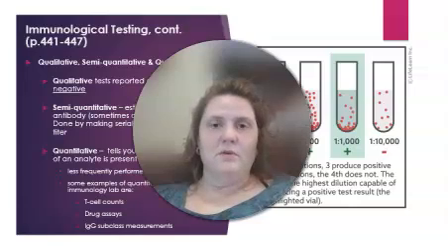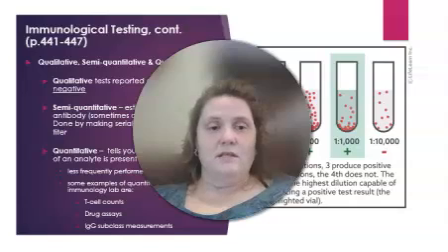Welcome back to the Unit 3 lectures for MLT 110. This is part 2. In this lecture, we'll be covering blood banking, in particular ABO testing.